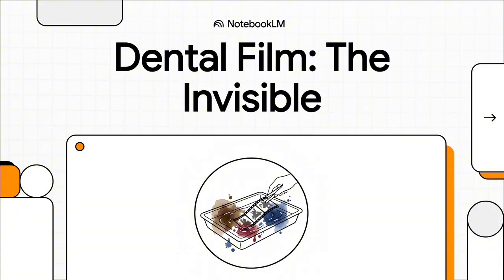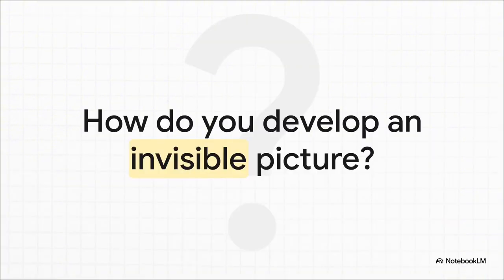Have you ever really thought about a dental X-ray? How can a piece of plastic that looks totally blank suddenly reveal everything hidden inside your teeth? Well, today, we are pulling back the curtain on that little piece of analog magic. We're going to find out how invisible energy gets turned into one of the most important tools in dentistry. So, right off the bat, here's the big question. How do you develop an invisible picture?